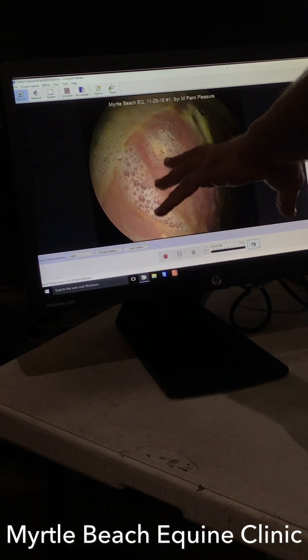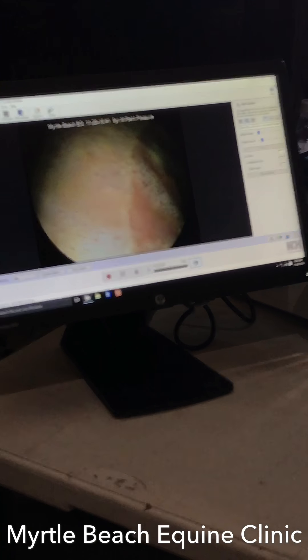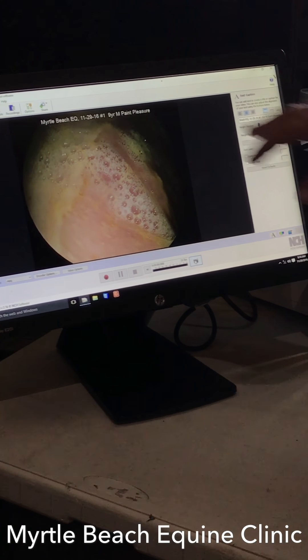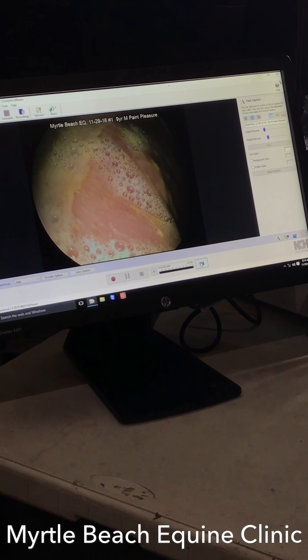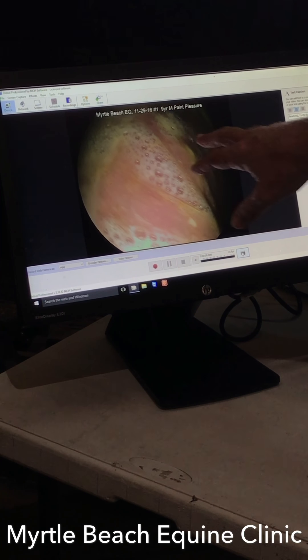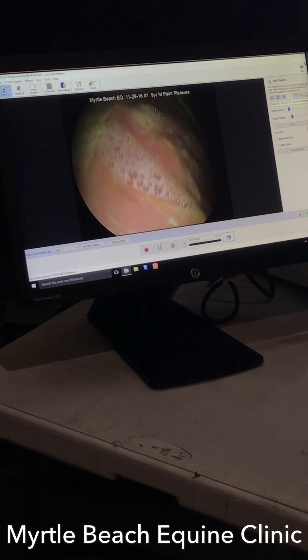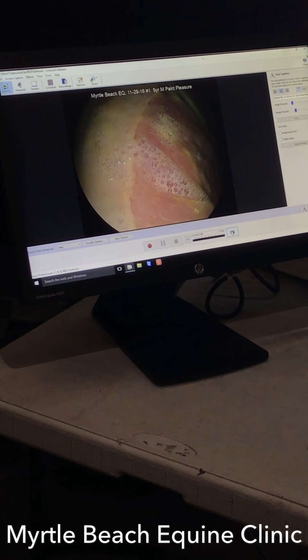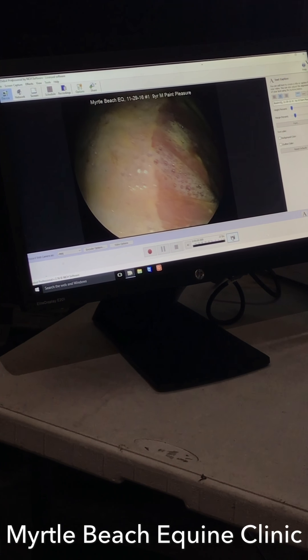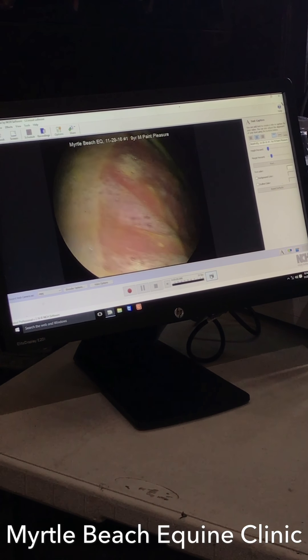This is the more glandular part. It's not as red as some of the other stomachs that we see, but it's a nice healthy pink. We'll get some of that foam off. This is the bottom because gravity works and fluid is on the bottom. But sometimes our camera is at different angles. This is the top part of the stomach — the squamous epithelium — where we've traditionally seen ulcers.